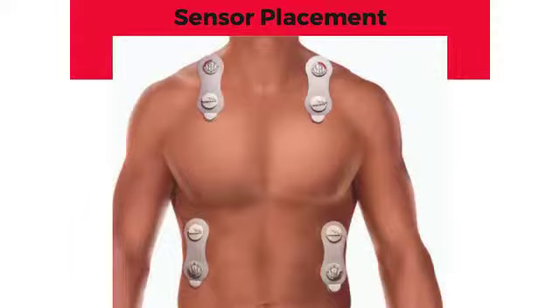Remember, we need to keep all four sensors on the actual torso of the patient, okay? So upper sensors can straddle the clavicle. They can straddle the trapezius, or you can march that sensor around and put it on the back of the patient. So sensors can go on the front or on the back. A couple of things here. The white tabs always need to point to the patient's toes, so you need to keep the sensor nice and vertical, even if you go on the back.